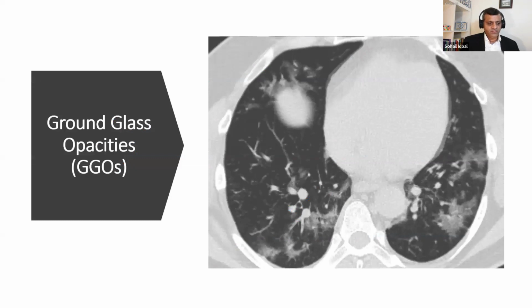Okay, so we have ground glass opacities. That's our next problem. With the consolidation, the tetrahedron construction kind of works. But when you talk about the ground glass opacities, they are connected peaks, but they are not going all the way down to the ground floor. They are just connected with each other. The peaks are connected with each other, and they are creating more and more saddle points.